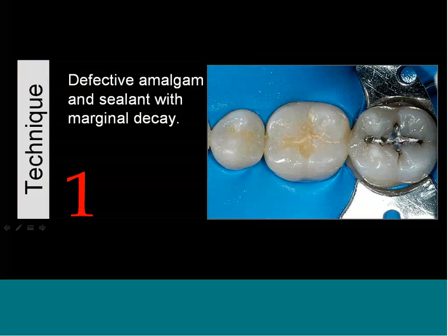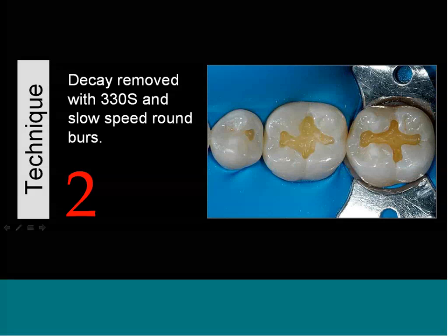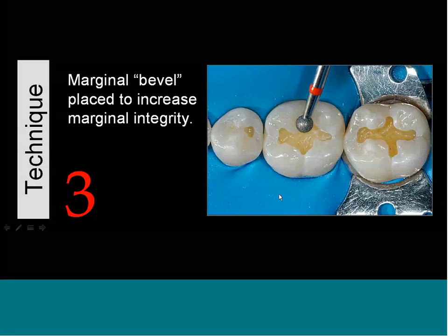So here we have a defective amalgam and an old sealant. They both have marginal decay. Let's see if my pointer works. There we go. My favorite instrument to use to get rid of amalgams, to start crown preps, to do pretty much anything is a 330S short shank, the little pear-shaped burs. So we take out all the old amalgam, take out the old sealant, anything else we don't like.